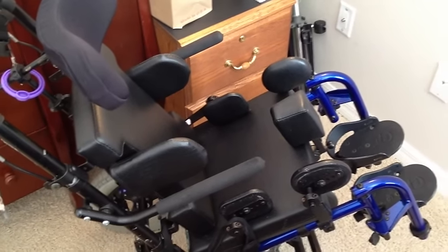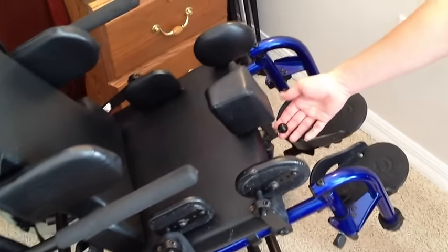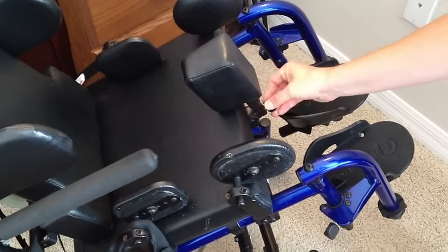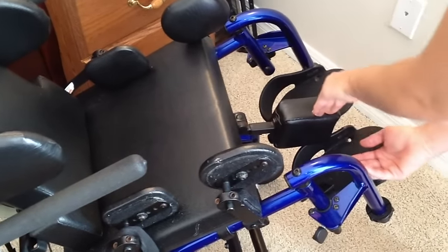Alright, it's time to get Eli into his chair. First you want to make sure that this little piece in the front is down. In order to do that, you've got to push in the little ball and then the whole thing will slide down, and that makes it a lot easier to get him into the chair.